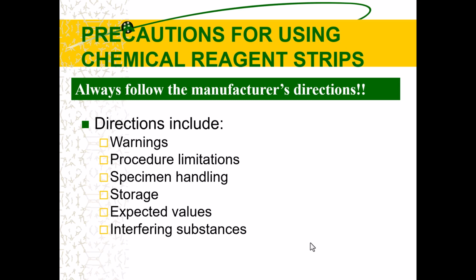Didn't think anything of it. It's still a red top. Well, what's on a red top tube these days? Clot activator, right? That clot activator is sprayed on silica, so glass particles. They found out that the plastic red tops weren't clotting because real glass has grooves for the platelets to start congealing, something to grab onto. The plastics were too smooth. So they sprayed them with this clot activator, silica, and I didn't realize it because I didn't read my inserts.